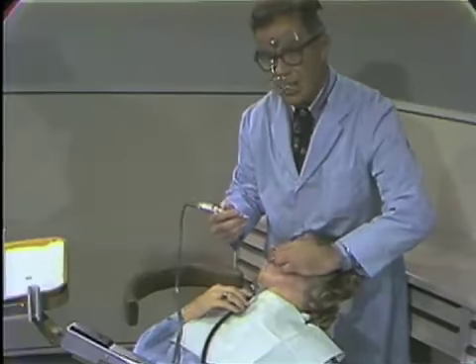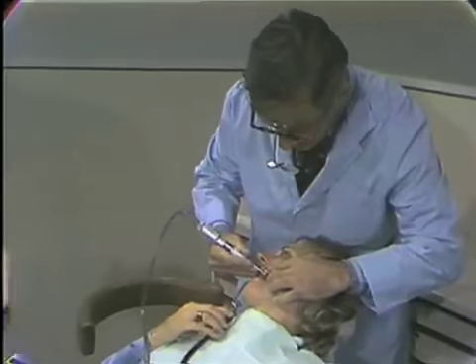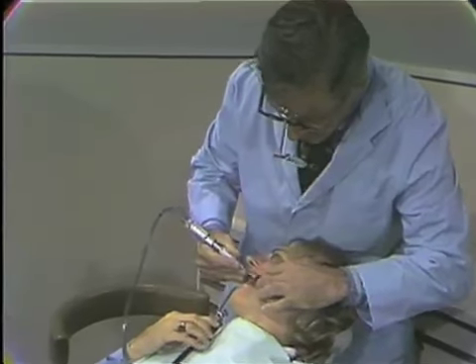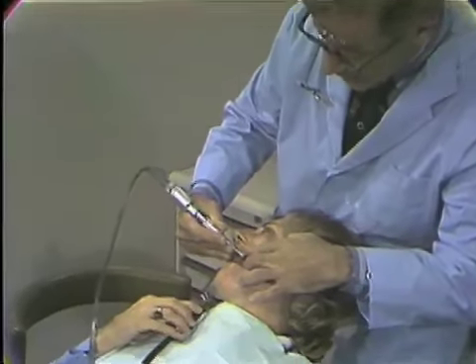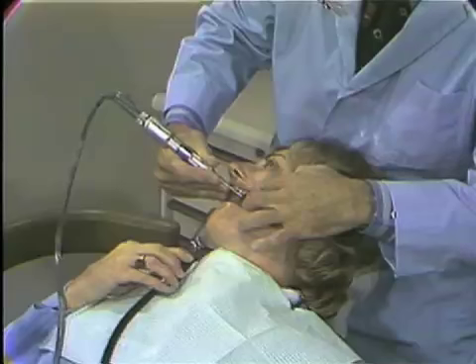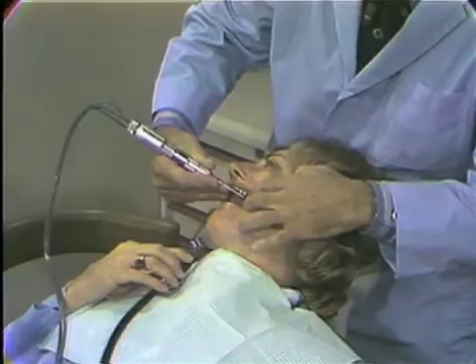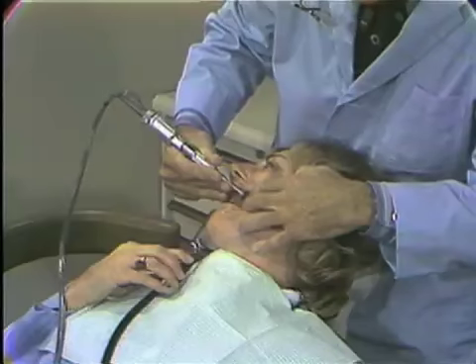Again, notice the fingers are protecting the lip and the cheek. And we now bring in the disc, and we can place it between the tooth that we are working upon. Notice the angulation. And I am, again, looking between the tooth and the disc so that I can determine the angulation that I wish or the taper that I'm going to place on the slice.